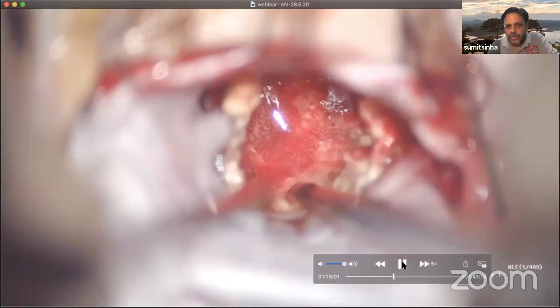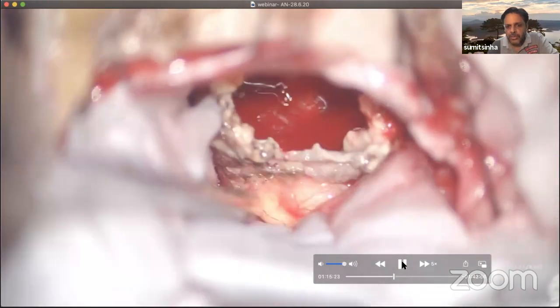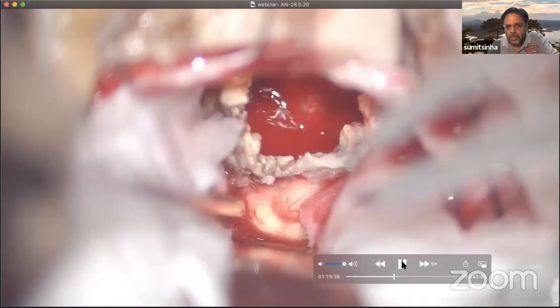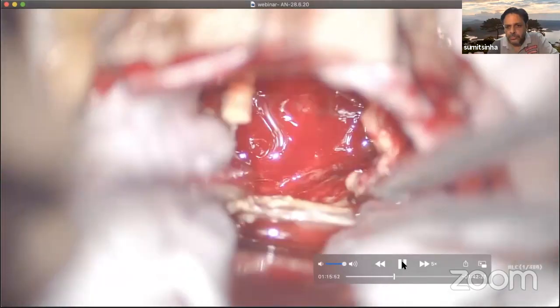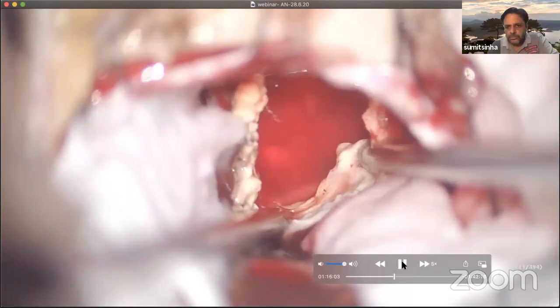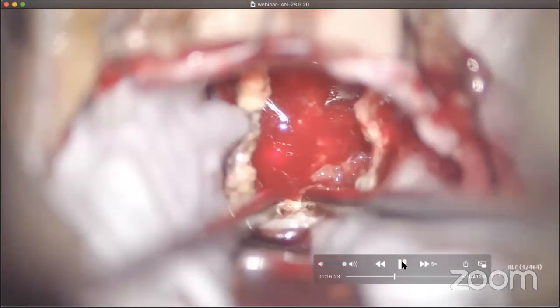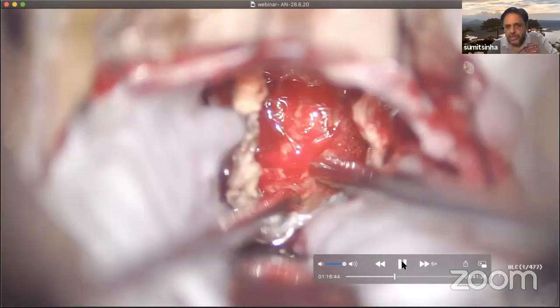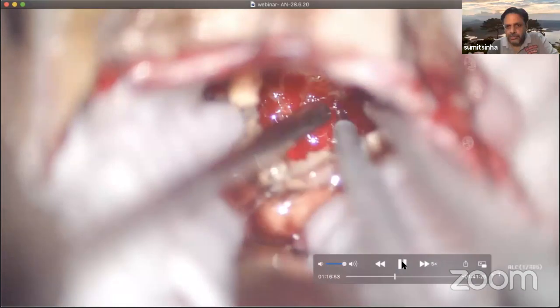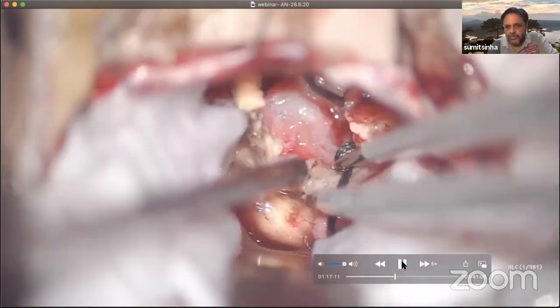Now this is the part where this is the brain stem. It is impinging on it. This is the medial part which is impinging on the brain stem. The debulking is taking place right now from the medial part of the tumor.